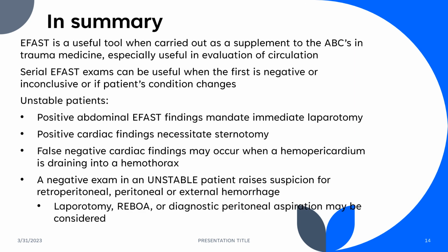So in summary, those are just a few scenarios of the millions of different things that you all encounter in clinical practice daily. Let's wrap up some of what we talked about today. Again, please share with your peers how you're utilizing the EFAST exam. Start to implement it on a level where you're comfortable until you feel like you can apply it in any scenario, and that's when it's going to become the most useful tool for you.